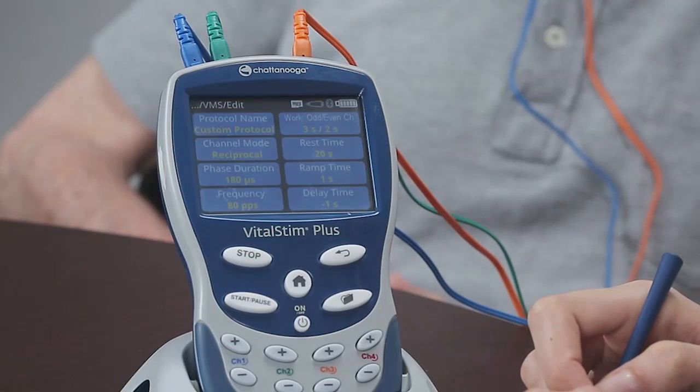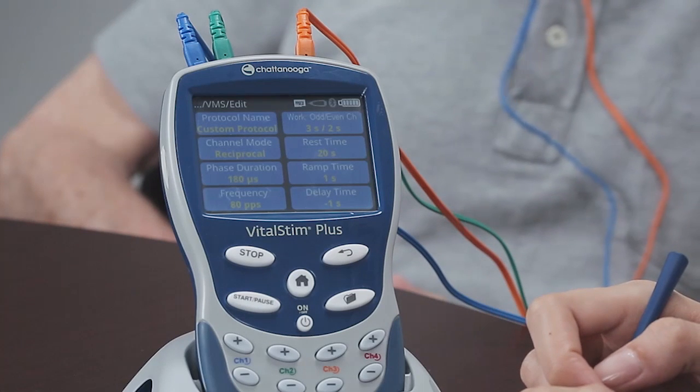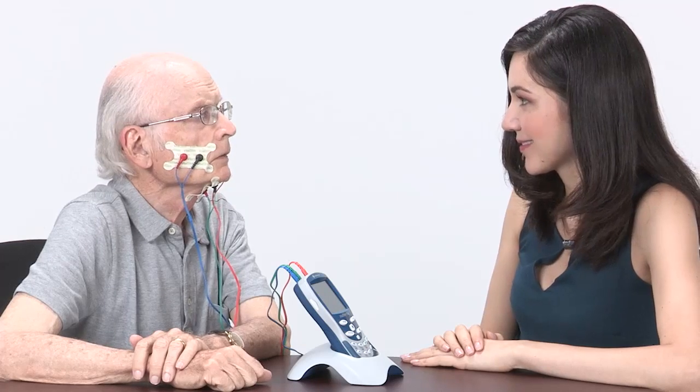The machine will first stimulate through the odd-numbered channels 1 and 3, and then through the even channels 2 and 4. Channels 1 and 3, my odd channels, are going to be on the oropharyngeal sling, so they will stimulate the contraction around the mouth. Then I will want for this patient channel 2 to join the contraction about 1 second later. All channels will finish at the same time.